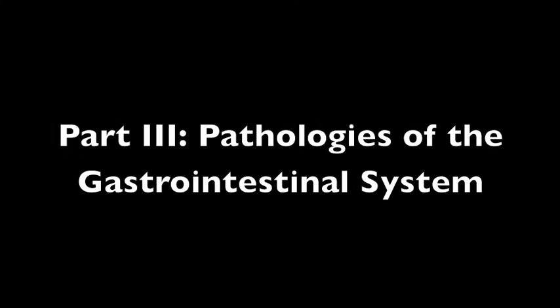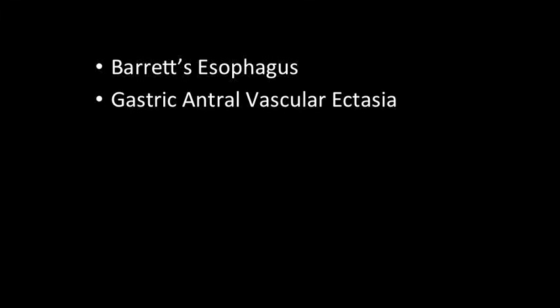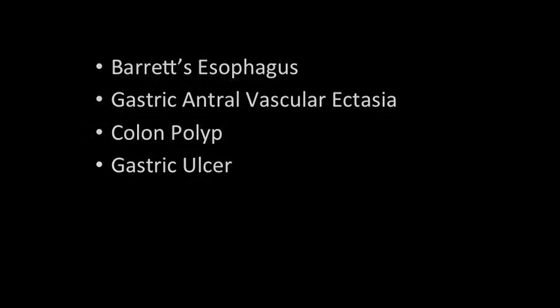In this final section, common pathologies of the gastrointestinal system will be investigated. These include Barrett's esophagus, gastric antral vascular ectasia, a colon polyp and removal procedure, and a gastric ulcer.